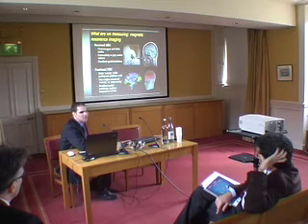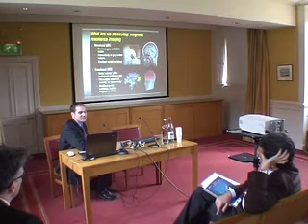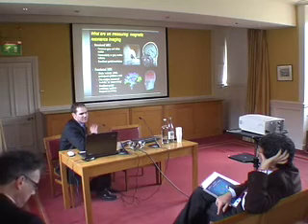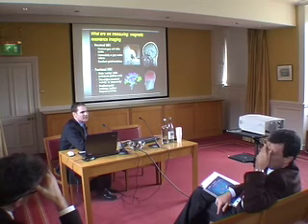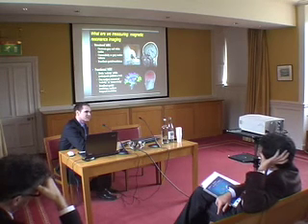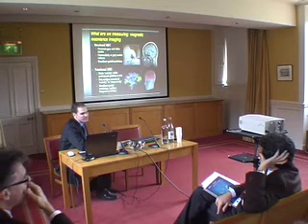But the part that probably most of you are most interested in is the functional MRI. So we can analyse something related to brain activity, I put activity in inverted commas, while the participants perform a task. But of course we're not measuring brain activity itself. So the value of fMRI is that you can measure things over short time periods, so you can give stimuli a couple of seconds or maybe 5 or 10 seconds apart, as opposed to a couple of minutes apart, so that's very useful. But it does give us a very indirect measure.